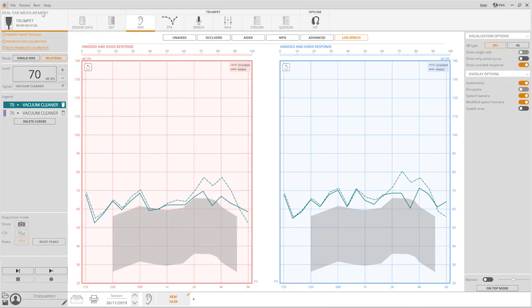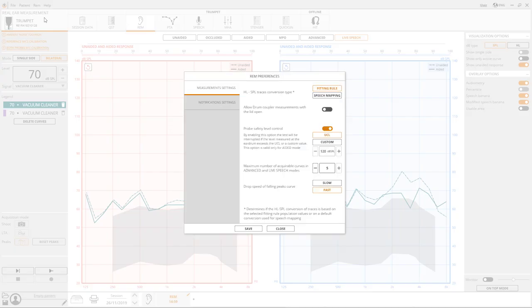Select the REM preferences from the REM menu and then the option speech mapping for the HL SPL traces conversion type.